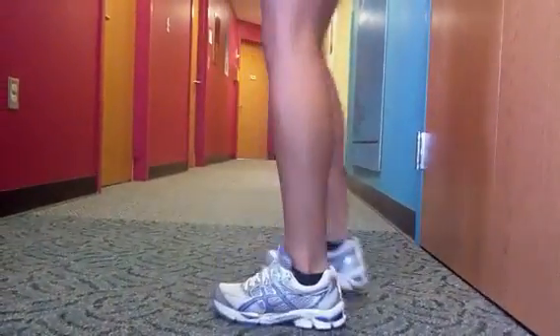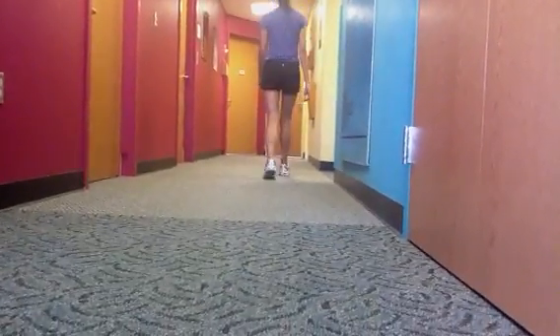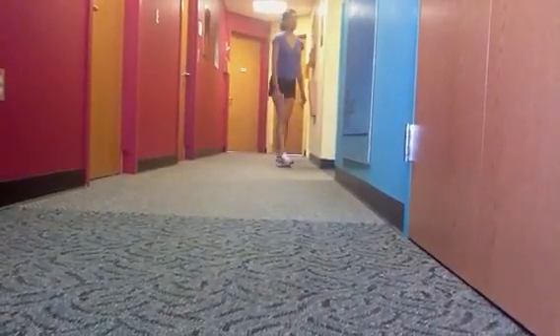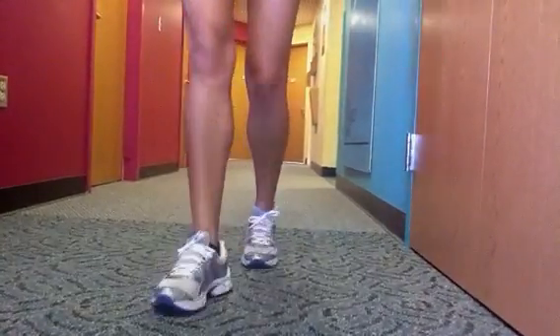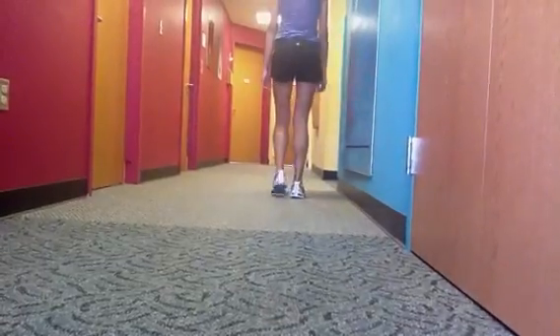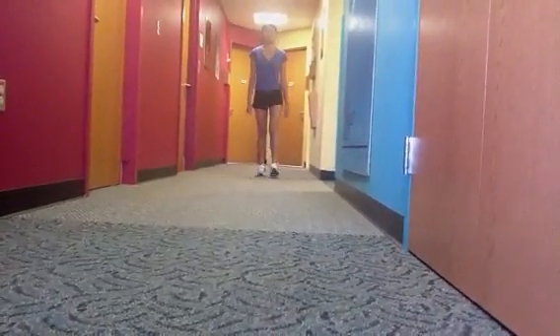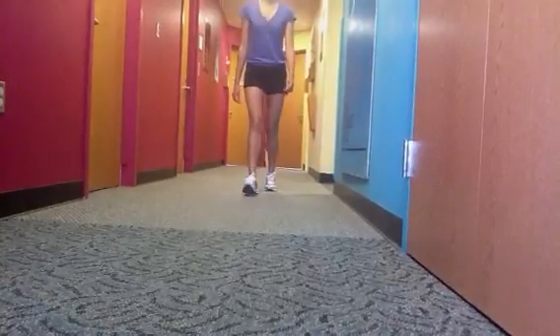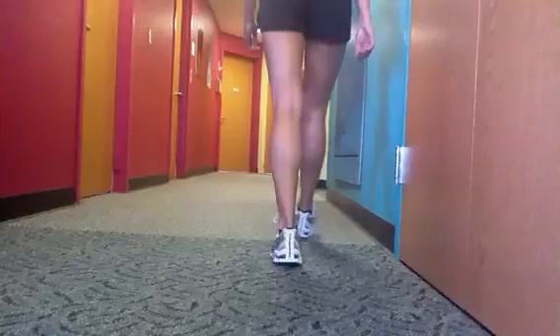And then if we look up at her knee and compare her knee motion to a previous video, you can see there is no varus thrust at her left knee that we had documented and discussed. So the varus thrust really crowds that medial aspect of the knee and should never, when you're working with orthotics, be created, or it will cause knee pain in the patients.